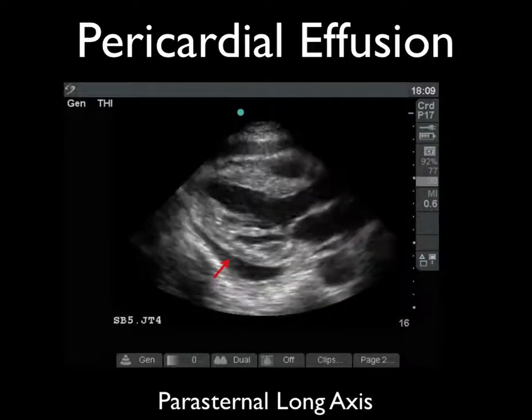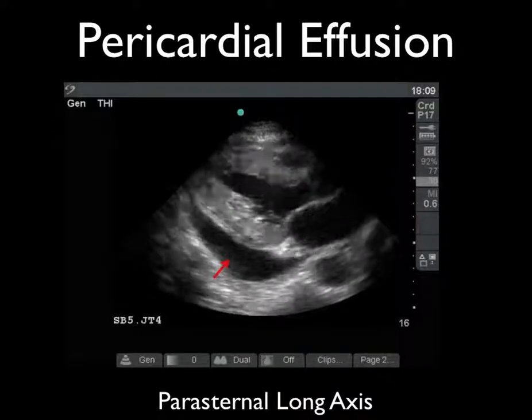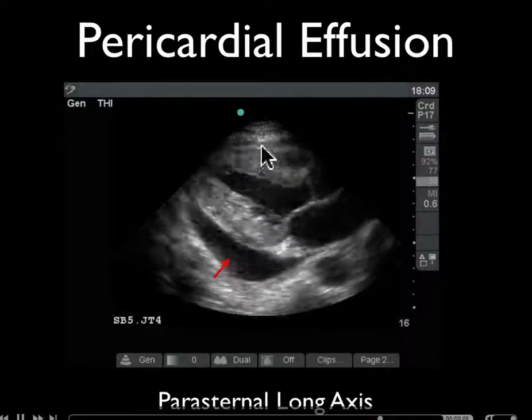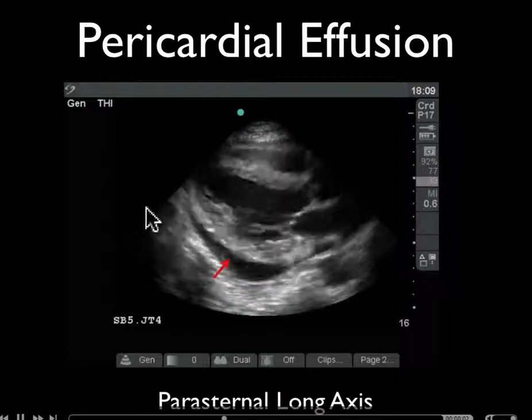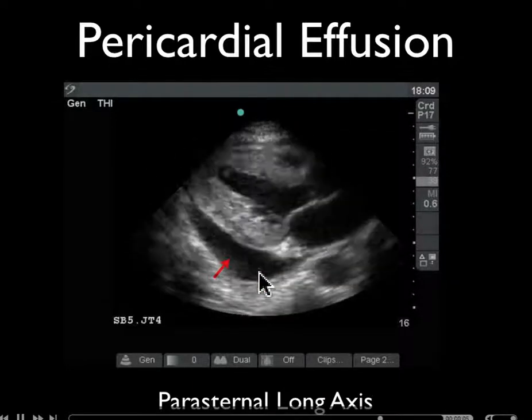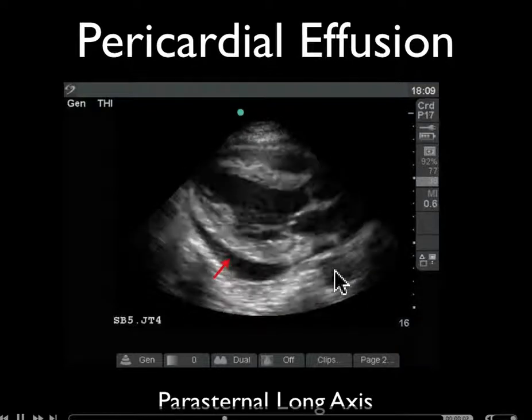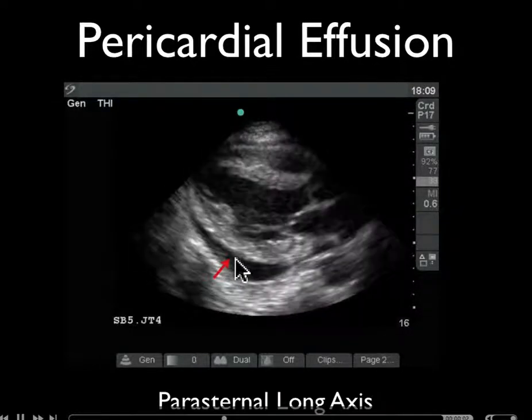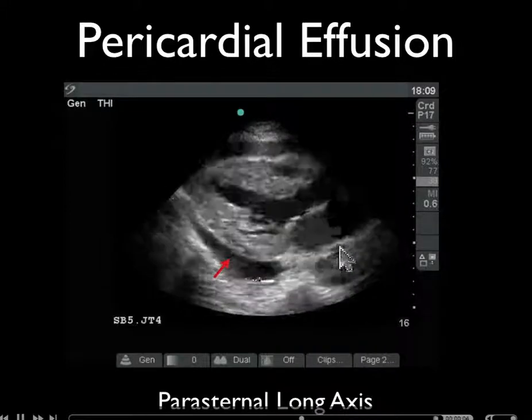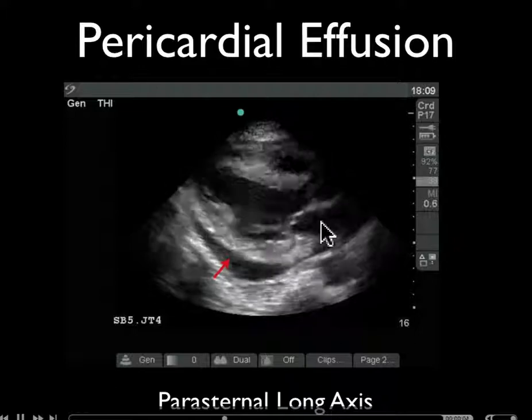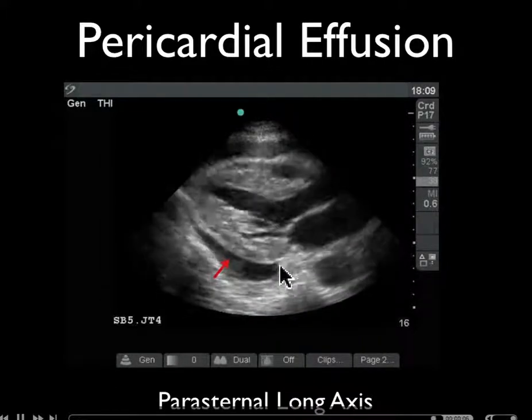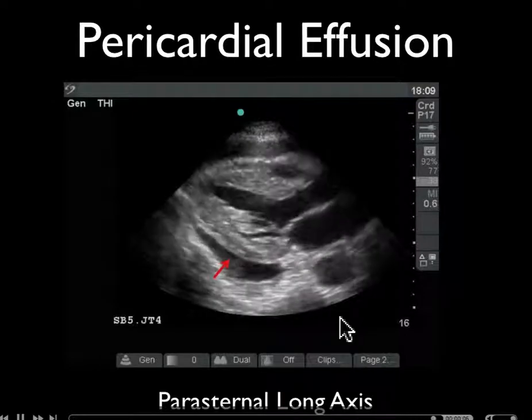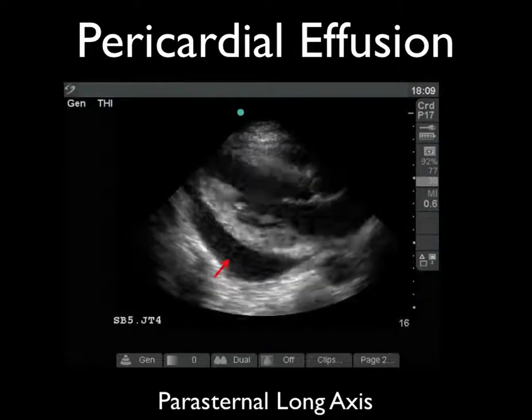In the parasternal long axis, this is what a pericardial effusion looks like, and we can see the heart swinging back and forth — we see that with larger pericardial effusions. Pay close attention to this: the circle right here is the descending aorta seen on the parasternal long axis. This pericardial effusion tracks anterior to the descending aorta — between the left atrium and the descending aorta. That's what defines this as a pericardial effusion. If the fluid tracked posteriorly behind the descending aorta, we'd be more worried about a pleural effusion.